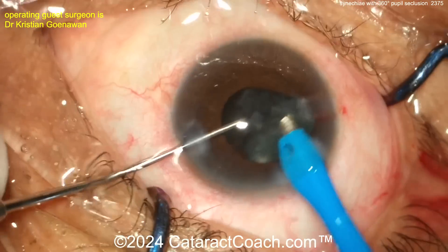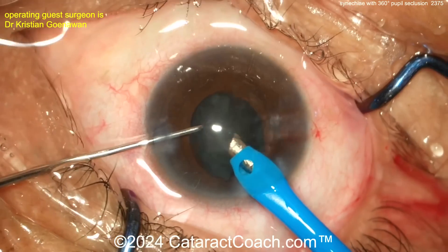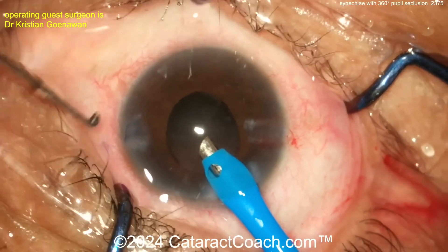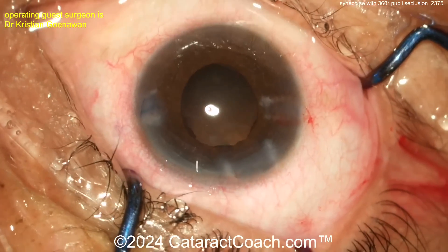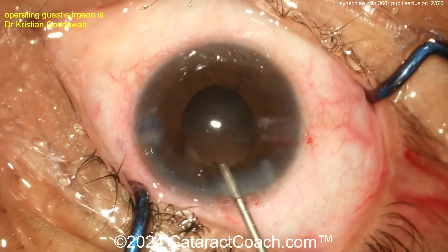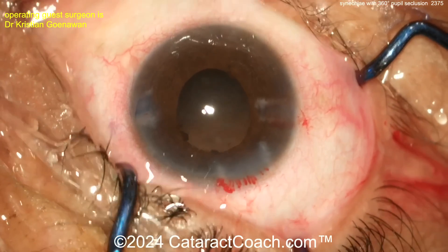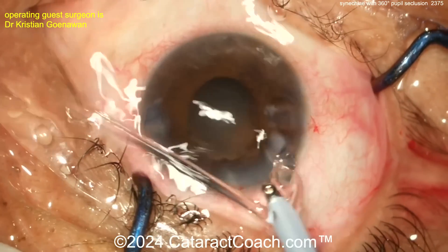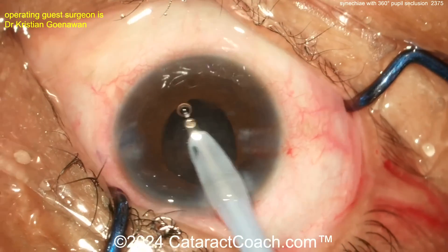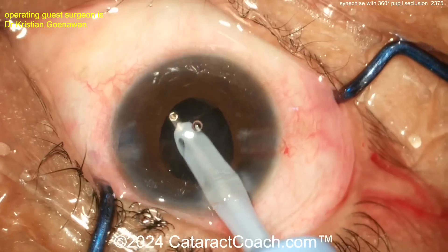Taking these pieces out nice and easy — keep track of where the pieces are, that's really important. Make sure nothing is remaining behind. Sometimes at the end I'll use the chopper to lift up the iris to get a better view, especially during cortex removal. With two paracenteses this may be a great time to do a bimanual approach for cortex removal. The capsular bag looks pretty empty; going in with the coaxial probe — don't grab the iris, go underneath it.